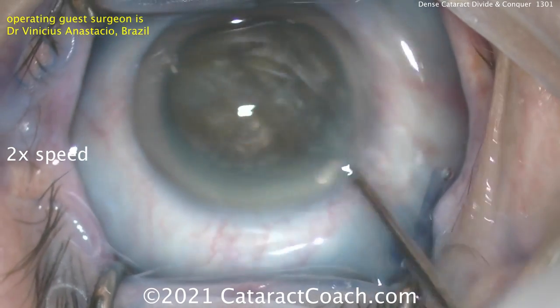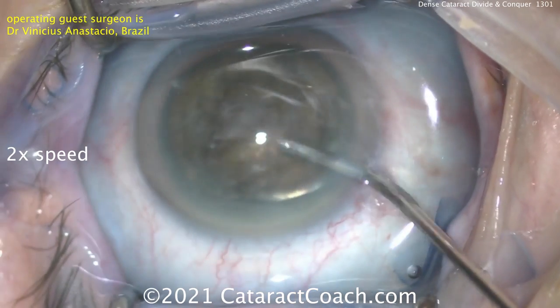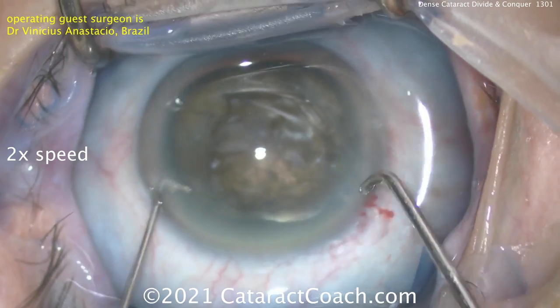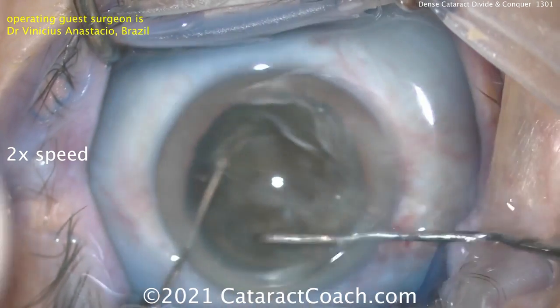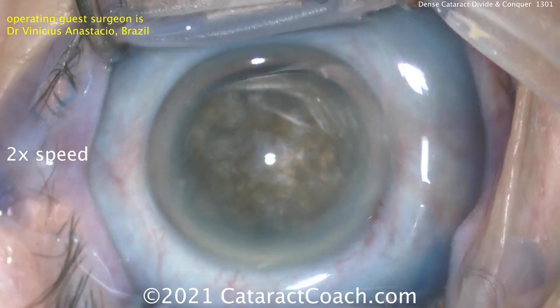He's just using the chopper. In a case like this, a lot of the cortex has already been liquefied, so there's really not a whole lot of cortex — it's mostly nucleus. Now he's going inside here and really getting that nucleus to rotate again. No hydrodissection — just using two choppers and getting that nucleus mobile.